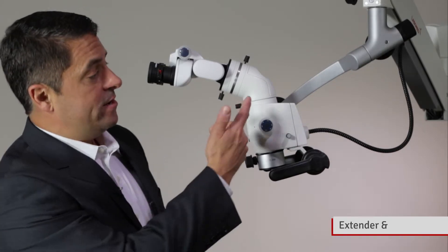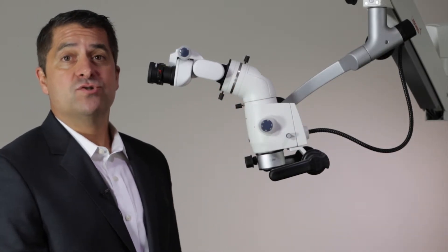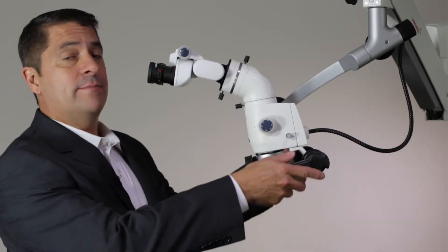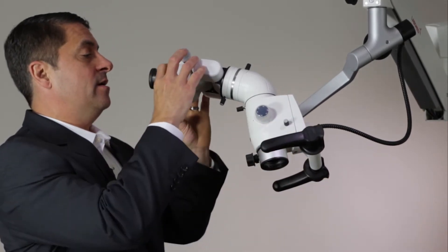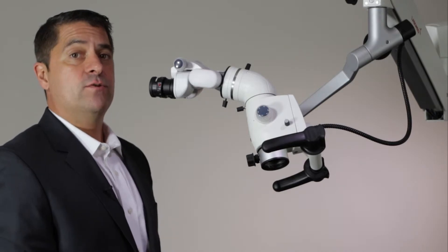Our 45-degree extender provides a more comfortable viewing posture by bringing the viewing head closer to the viewer. The rotoplate accessory allows you to tilt the microscope up to 30 degrees in either direction, while keeping the eyepieces aligned to the user, creating a more comfortable viewing posture.